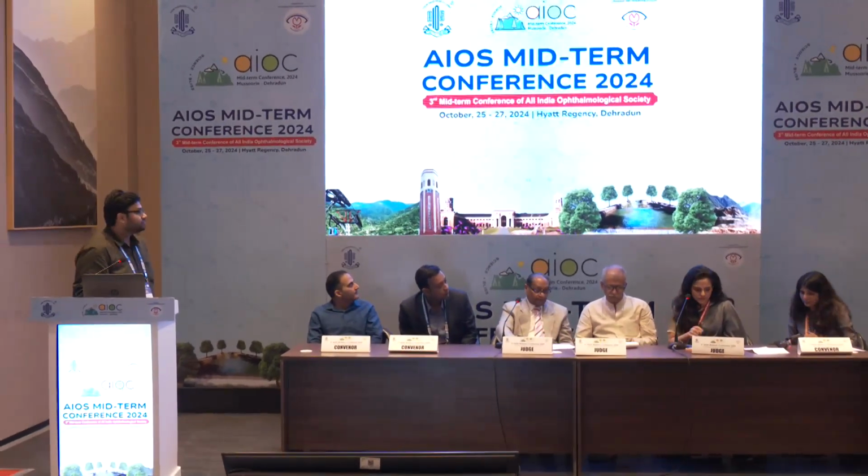Here you said that you're going to clinically correlate this with the fundus findings, and I saw that the posterior staphyloma you detected only on B scan. You did not mention the posterior staphyloma in your clinical findings. Why I'm saying this is that the RNFL thickness would be much thinner in patients who have a posterior staphyloma, because the retina would be more stretched in that area. So those patients would definitely have a thinner RNFL.